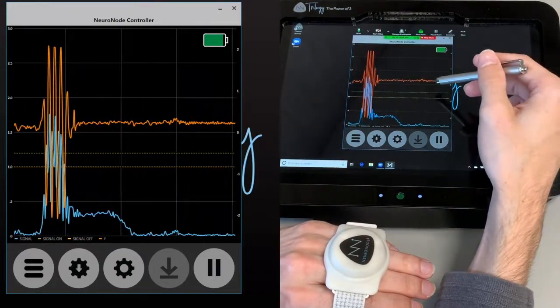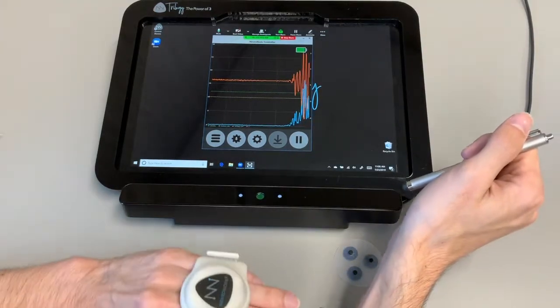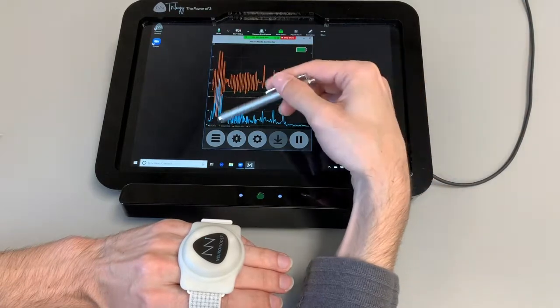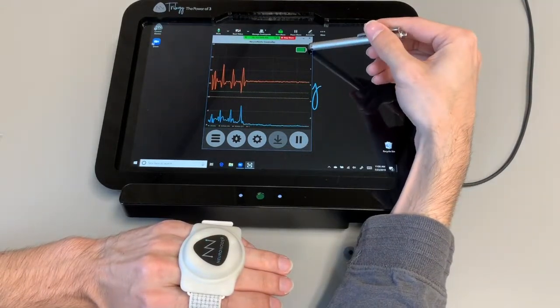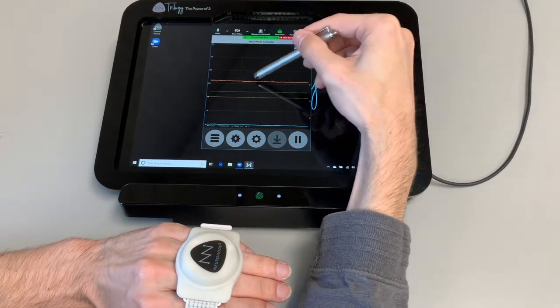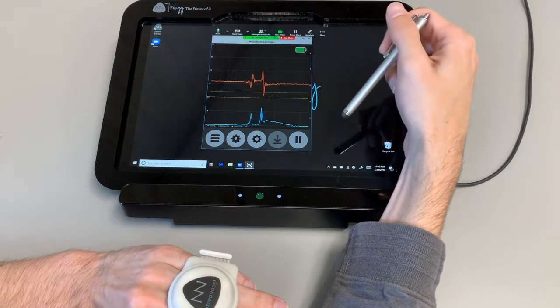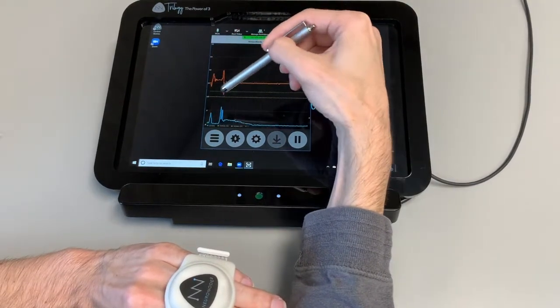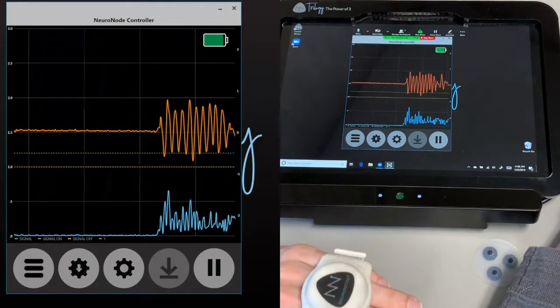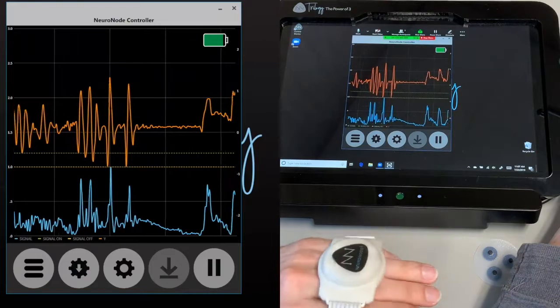So where it's at right now, it's probably a little high for us to actually reach that green and yellow line, or to pass the green line. So instead of trying to shake it heavily, let's get to the point where we can do this motion just enough to send it above that threshold. It looks like there is a right side and a left side to these numbers and they are different. The right side pertains to these colored lines up here — the orange line is basically showing that you've got motion in one direction or another. The one we're focused on is the numbers on the left, which pertains to our blue signal line. We can probably get to about 0.5 in some scenarios with a nice shake or even a tilt, since it's still that same direction. So we can get about a 0.5 somewhat reliably.